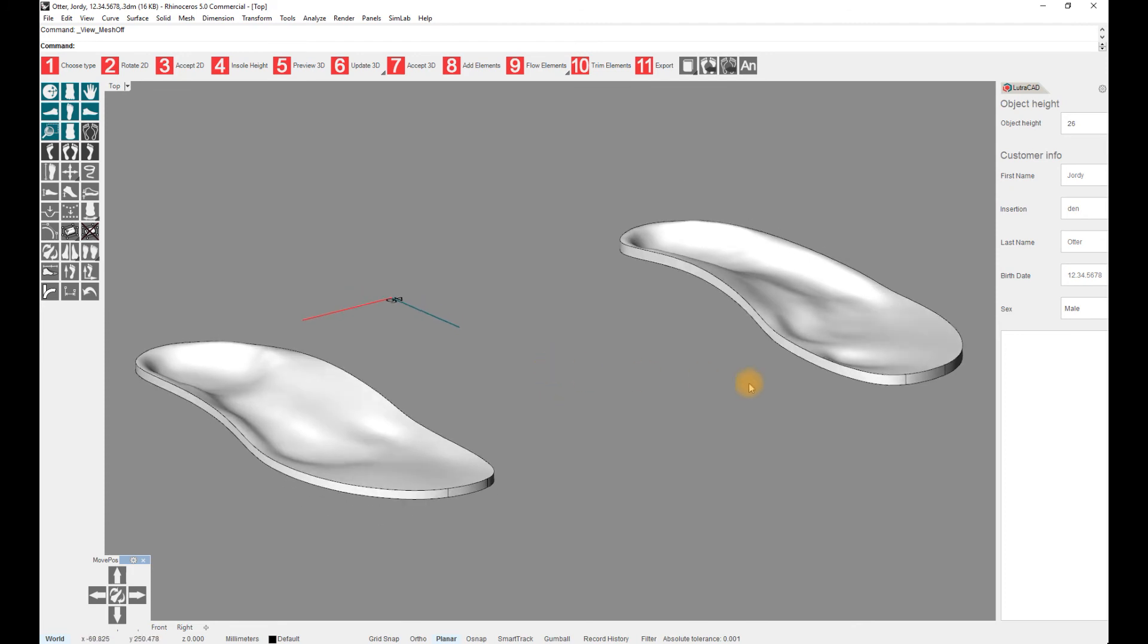As you can see, the big toe is a bit deeper and can be corrected by selecting Flatten Front Foot.